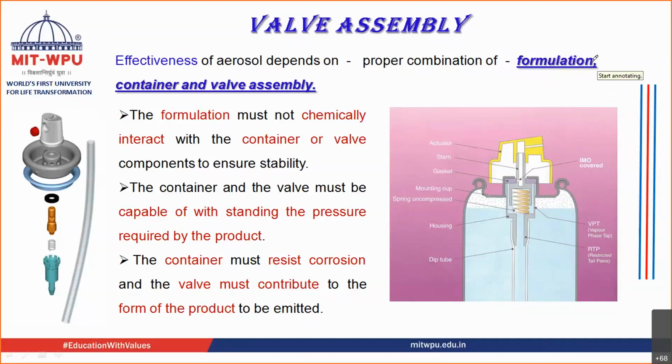So it depends upon your propellant, your formulation, your container, and it also depends upon the valve assembly. All these four basic components are very important in order to have effectiveness of your pharmaceutical aerosol.